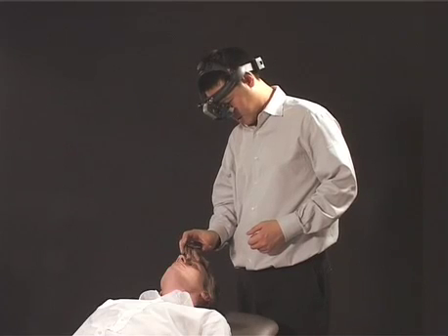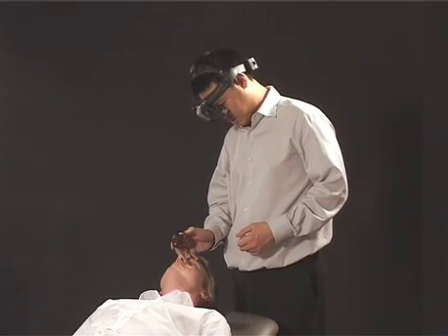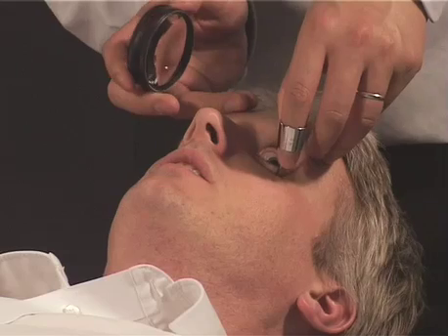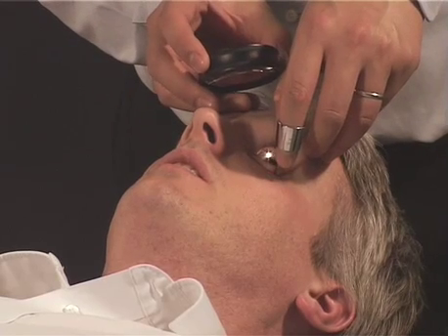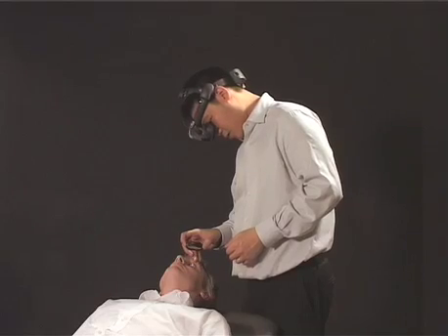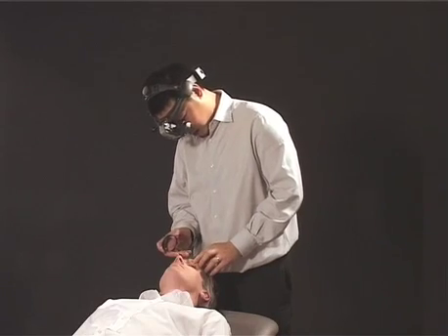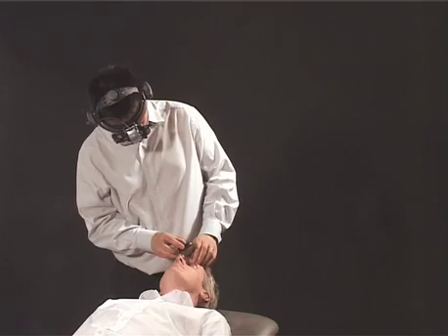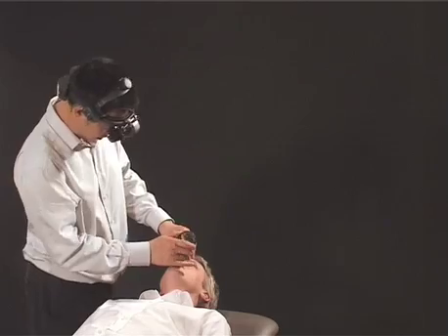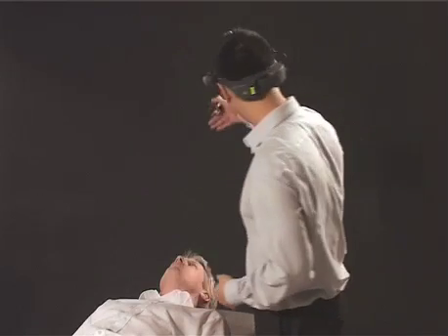When performing a comprehensive examination of the fundus, most examiners stand at the head of the couch and begin by viewing the inferior retina first. This area is the easiest to indent in terms of both access and patient comfort, which helps to put the patient more at ease. Work your way around the eye, moving your position as needed together with the patient's head and gaze position in order to retain an optimal view. Examination of the more sensitive posterior pole should be left until last, finishing off with the optic disc and macula.